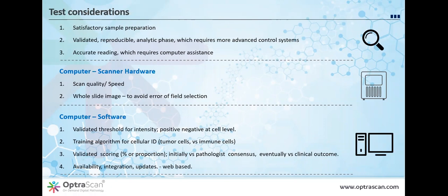The Optra assay gives the advantage of being able to do tumor percentage as well as immune cell percentage, or combining tumor and immune cells to get a composite score. And these different scoring systems are part of the different approved assays that are out there. With that, I'm going to pass you across to Isha, who will continue from here on, and I'd be pleased to deal with questions at the end if there are any. Thank you, Isha. Thank you, Dr. Taylor.